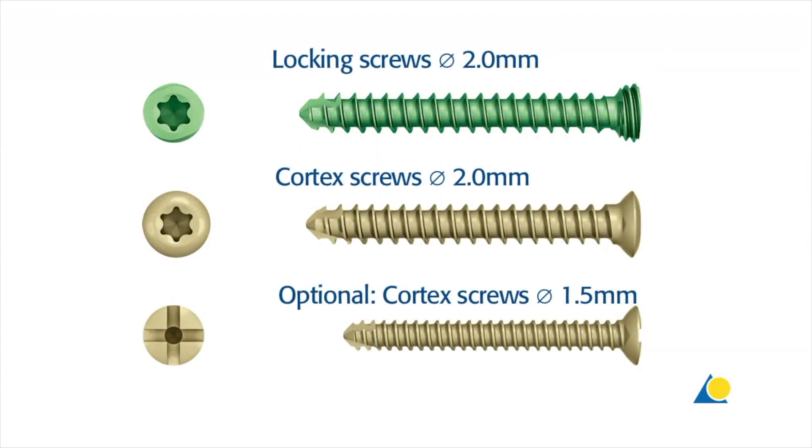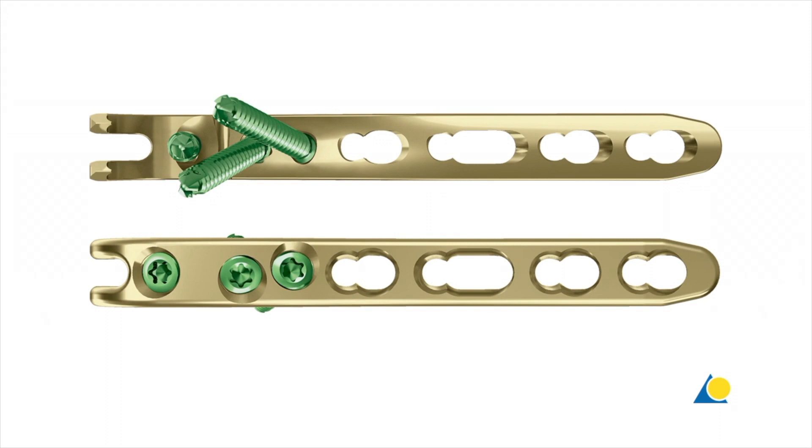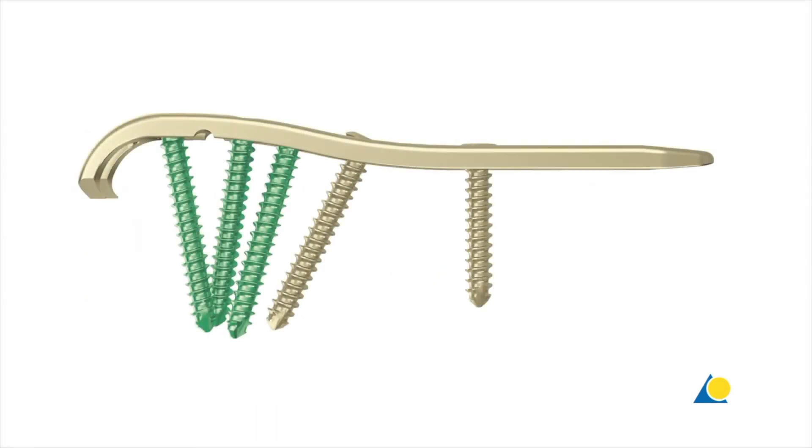The plate accepts 2mm locking screws, 2mm cortex screws, and as an option 1.5mm cortex screws. The intercrossing 2mm locking screws securely hold the ulna head. The oblong plate holes accept 2mm cortex screws for ulna length adjustment.